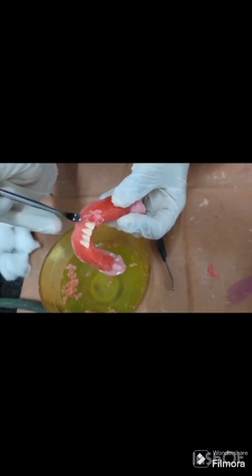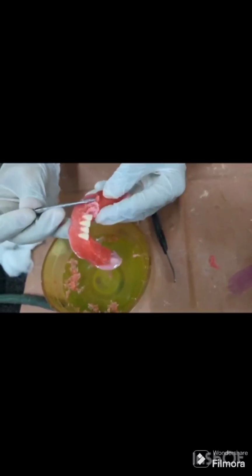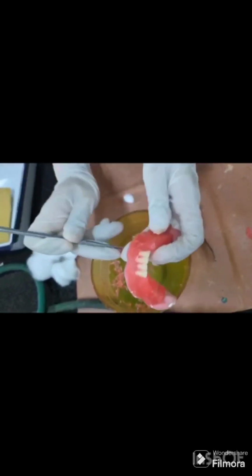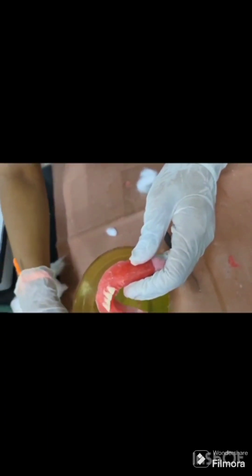Next, arrangement of the mandibular canine. Its long axis leans slightly towards the midline when viewed from the front. The cervical margin is more prominent than the incisors. The incisal margin is 2 mm above the occlusal plane.